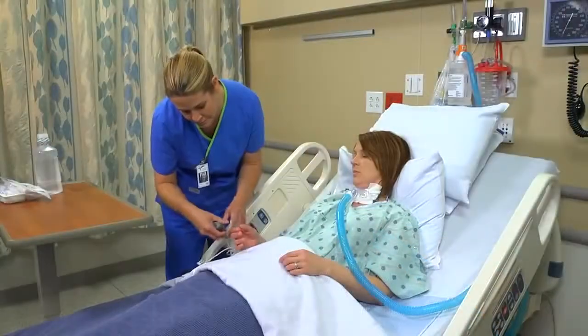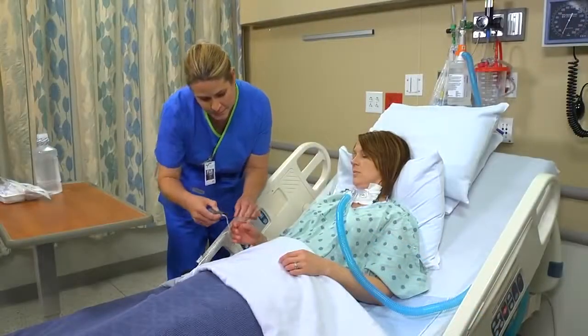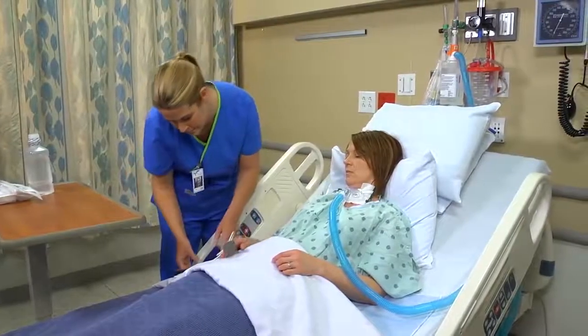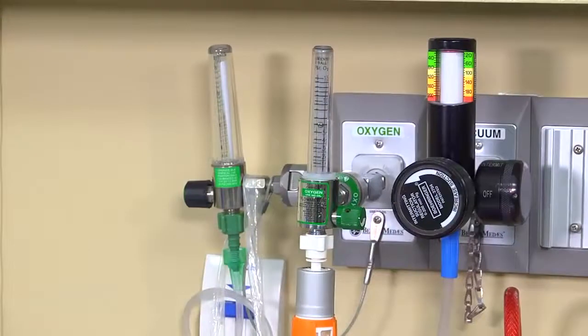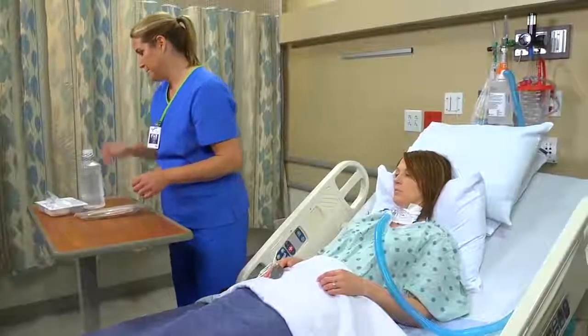Begin your care by clipping a pulse oximeter to the patient's index finger — either hand is fine. If oxygen delivery is needed, be sure that the sources and humidification are in place and have been set to the correct levels. Arrange your equipment on the overbed table.